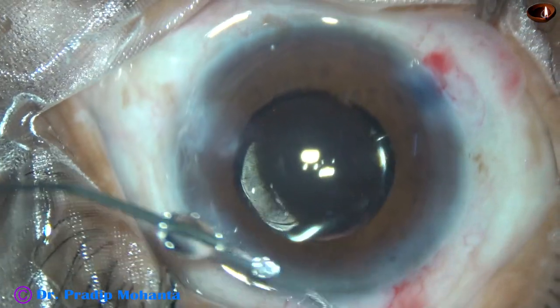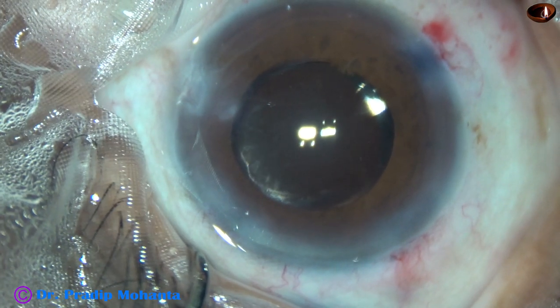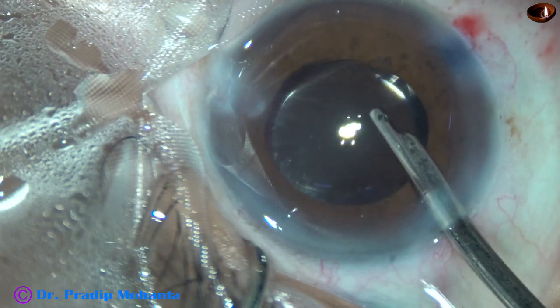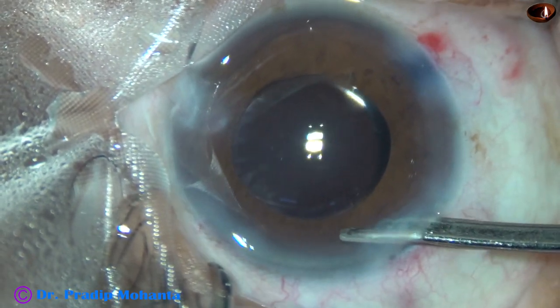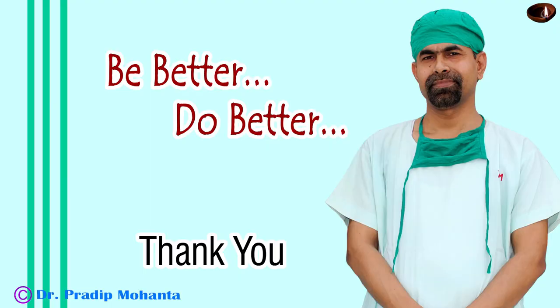In this case, we have seen the Submarine Chop technique and the use of preservative-free adrenaline. Adrenaline can help in some cases to a great extent — it can help us manage small pupil cases without using pupil expansion devices in many instances. Here we conclude the case after forming the anterior chamber nicely with BSS. The integrity of all the wounds is checked and the case is concluded. Thank you very much for your attention. Hope this video will help you in developing your surgical skills. Be a great surgeon and serve your patients with love, respect, compassion, and great surgical competence.